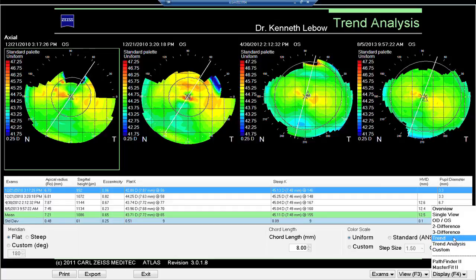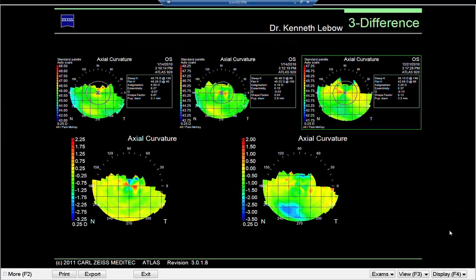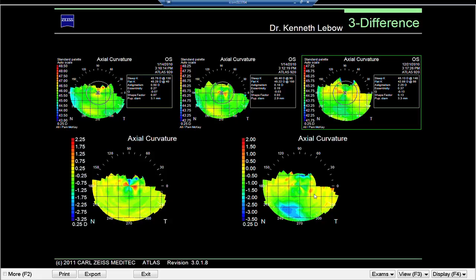If you have a shorter period of time to look at, another way of doing this is the three-difference map. You have two axial curvatures plus a third on top — the difference map is below the first two, and the difference map of the second and third is below that. This is very useful for dealing with refractive surgery patients — it will show you the immediate surgical effect and then the healing effect over time.